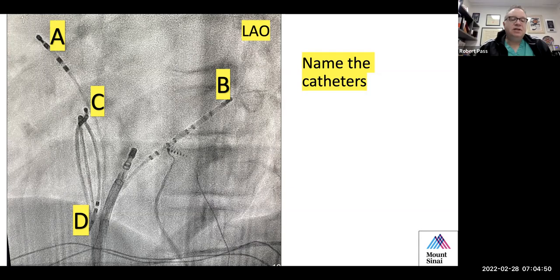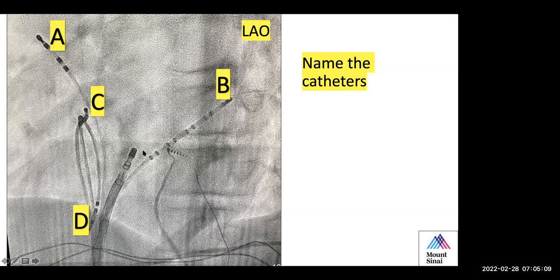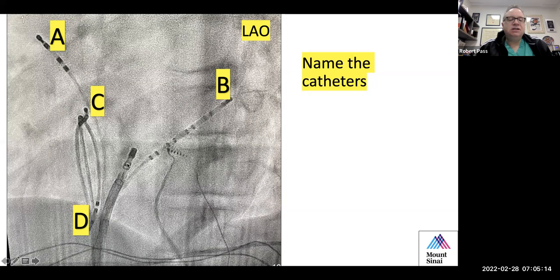Oh, the His. Okay. Right. So it's normally near the His. So where is this closer to? This is the coronary sinus catheter here. So it's very close to the mouth of the coronary sinus, right? So you would say it's usually the posterior septal region of the right atrium.